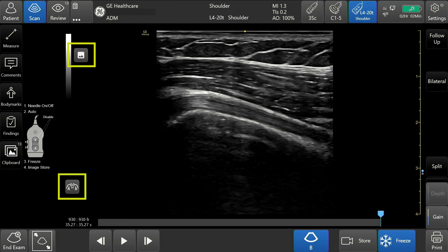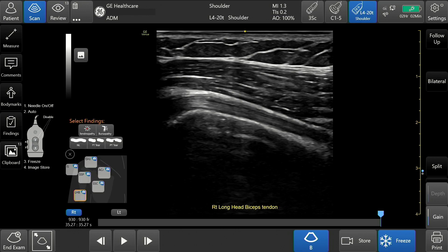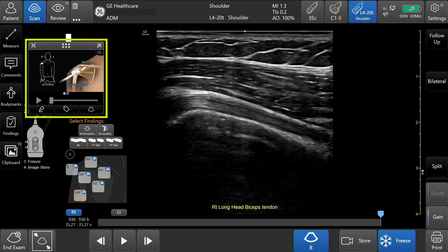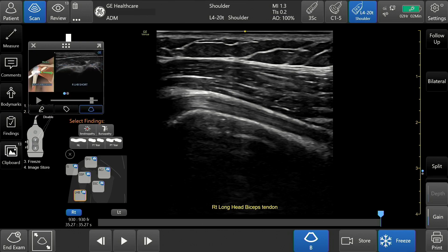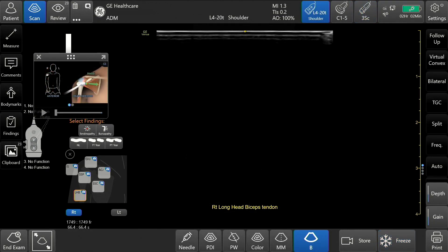Tap each icon again to display them. The graphics display includes probe position, anatomy, and reference image. Swipe right or left for additional views. Reference image is available only when using the shoulder diagram. During patient scanning, the reference image assists in acquiring the correct view and orientation while performing a scan.